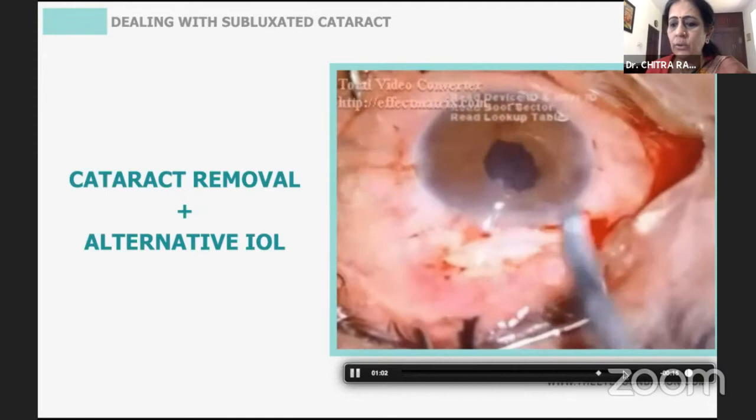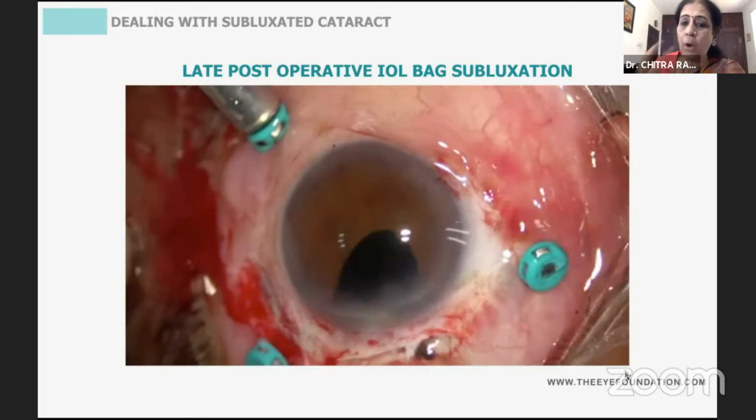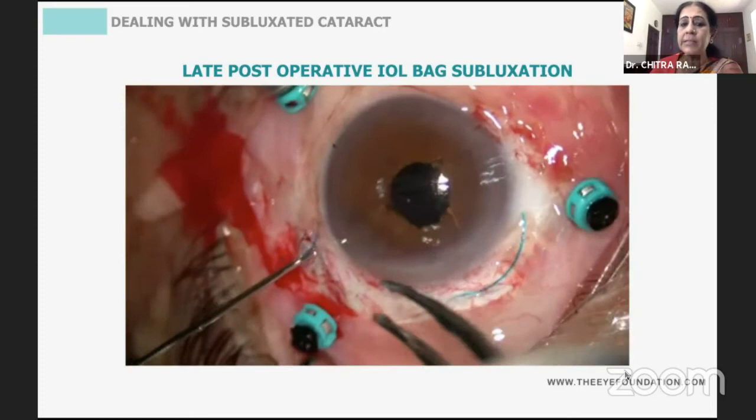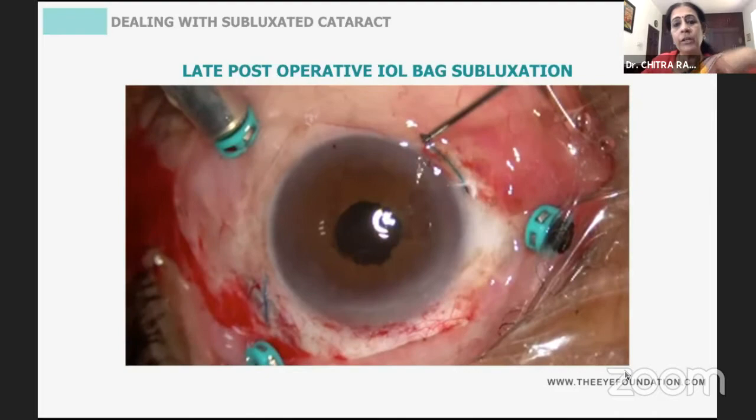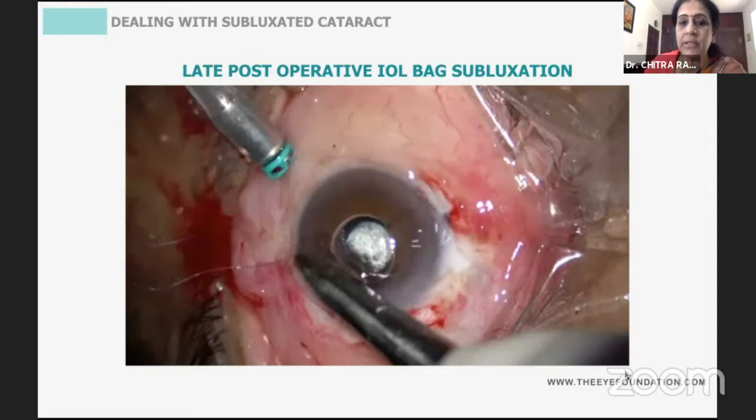But last, if it's a progressive dialysis, you might find that you're caught in a situation where the capsular bag and the IOL are all in the vitreous, and then you need your posterior segment surgeon to help you get your IOL capsular bag complex and then go in place a scleral fixated IOL. So this is the way the history of a zonular weakness progresses, but there are ways to deal. If you do it cautiously, you could do it just with a CTR and a CTS, or rarely two CTS, or in an extreme situation, an iris clip lens or a scleral fixated IOL is what you would need.